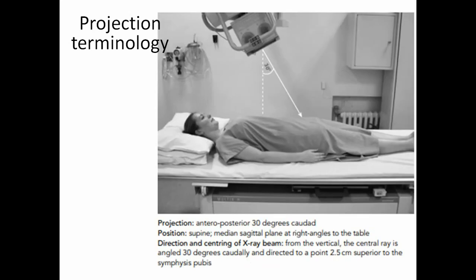This is angulation. The patient is lying down in supine position. Sometimes we need to give caudal angulation or cranial angulation. In a chest radiograph, for example, the sternum overlaps the lower part, and if you want to see something about the mediastinum, the sternum will be overlapping. Or sometimes a small nodule is there but a rib is overlapping it. If you want to avoid that, we give angulation to avoid the rib overlapping the nodule. That is what is called an angulated view.